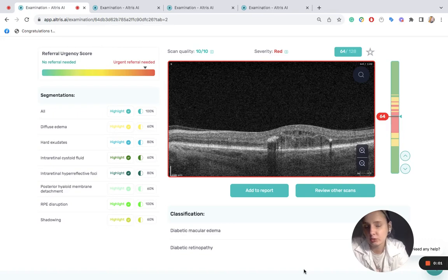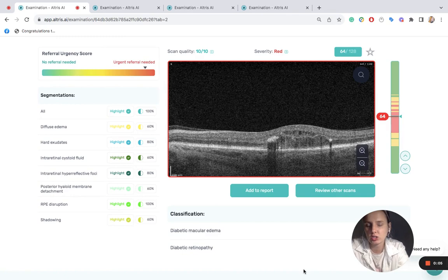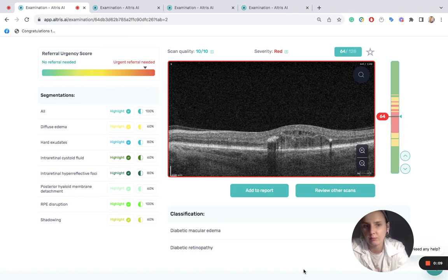Let's take a look at how Altri-CI detects diabetic retinopathy, one of the major eye conditions that can lead to significant vision loss if not detected in time.